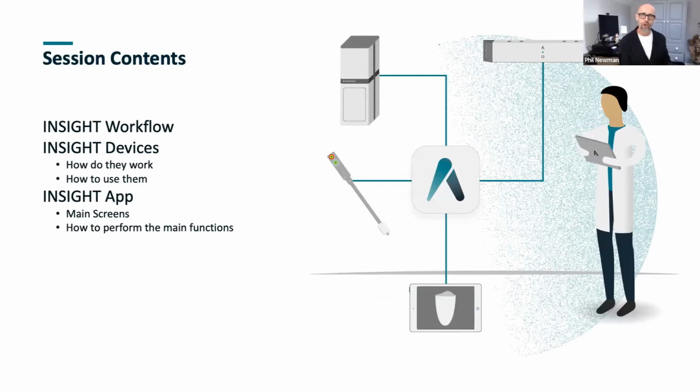So we're going to be going through the INSIGHT workflows first of all today, and then navigating you through all of the different devices, the component parts of the system, and then obviously showing you how the app works in great detail.